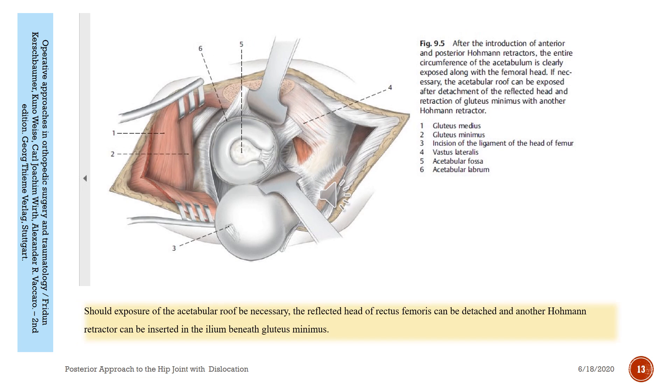Should exposure of the acetabular roof be necessary, the reflected head of the rectus femoris can be detached and another Hoffmann retractor can be inserted in the ilium beneath the gluteus minimus.